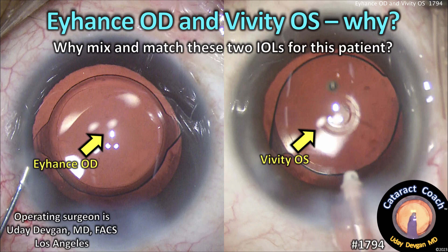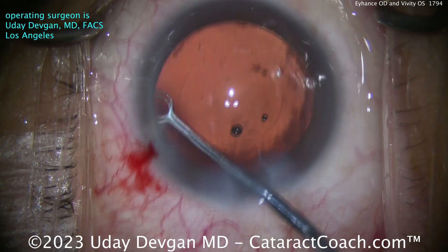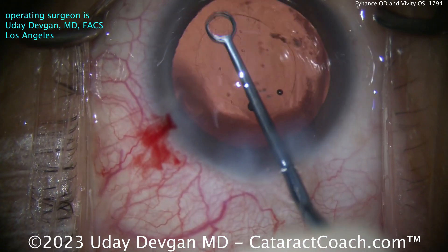cataractcoach.com — iHance in the right eye, Vividly in the left eye. Why is that? Why are we doing mix and match for these two IOLs with this patient? Here's the first eye, this is the patient's right eye.